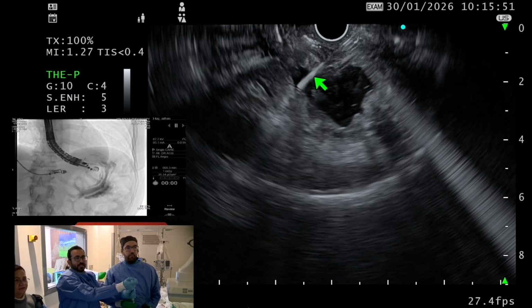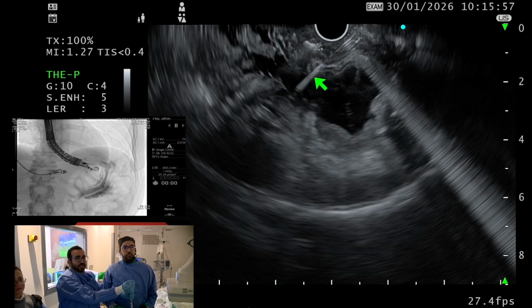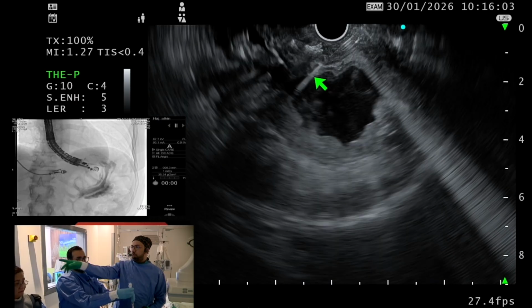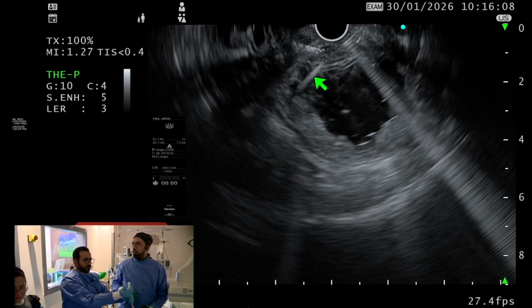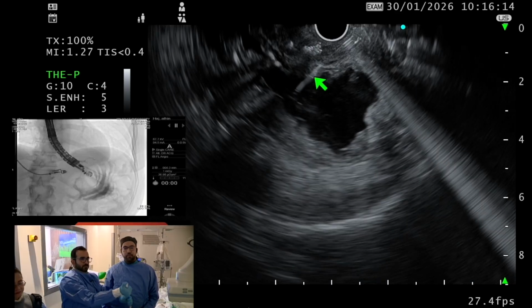Okay, so now I just keep inflating. Sometimes it's tricky to inflate the stomach that is post-sleeve. So this patient has a sleeve, right? Actually, I think she has no sleeve, because if you look at the fluoro now, it's clear we are dealing with a large stomach. So probably this is just a classic Roux-en-Y gastric bypass.